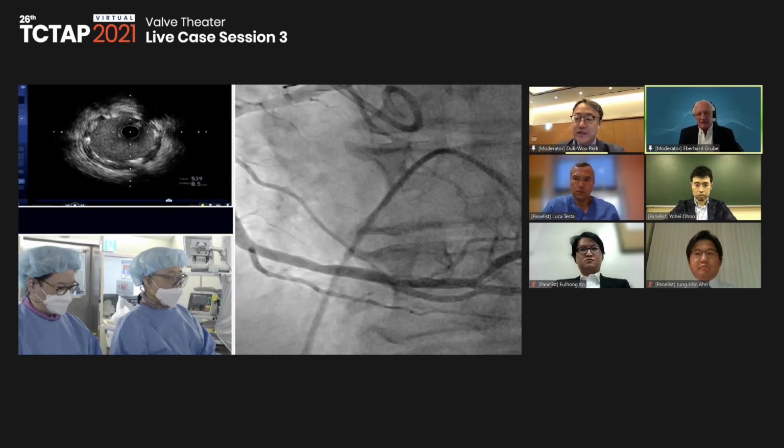Yeah, I think that's an interesting case given the previous history of lung cancer. I would probably do the same thing that you've done: look at the coronaries, minimize everything around it, and then proceed with the TAVR, because that's what actually makes the projected surgery possible.